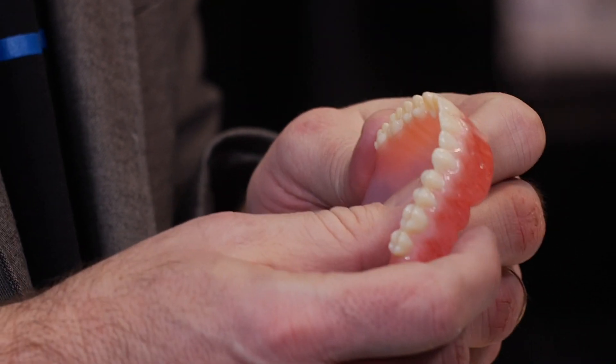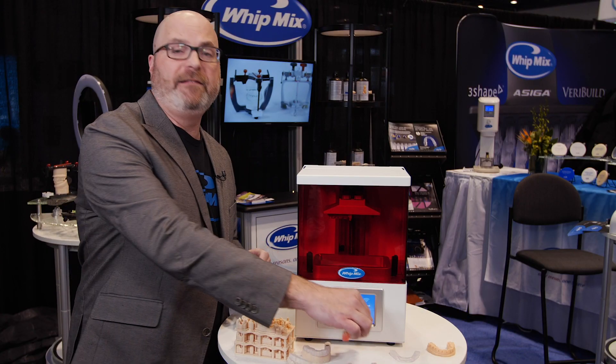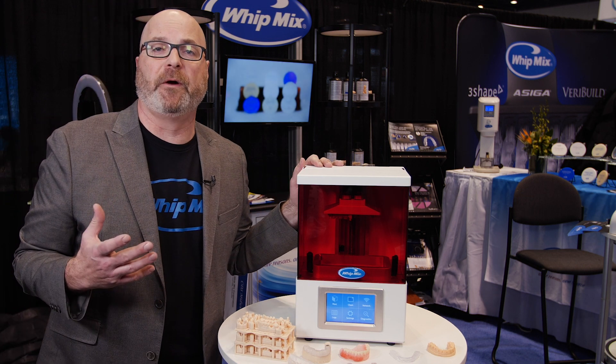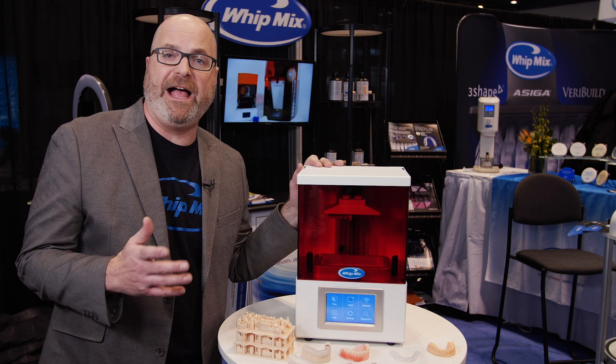Denka currently has a denture base and a teeth material, and just recently Denka announced they now have a temporary material for this printer. They received approval for their temporary material that can be in the mouth for one year or less.